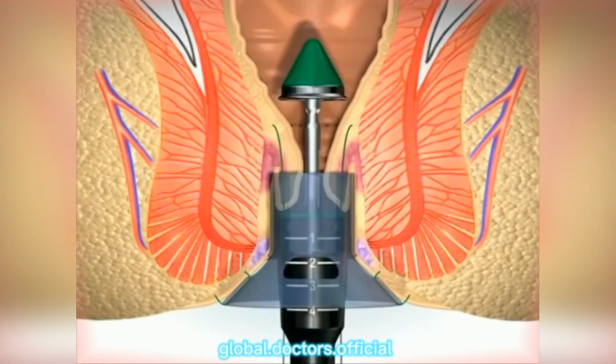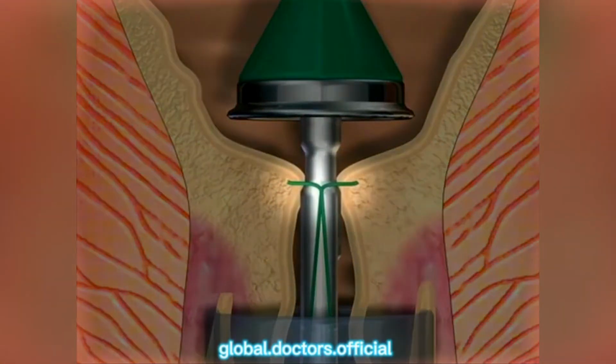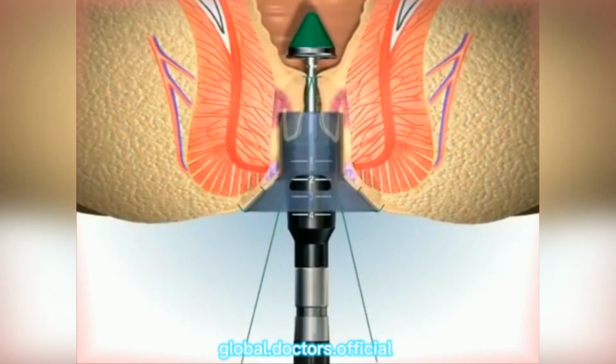inserted with the anvil placed beyond the purse string suture. It must be confirmed that the anvil crosses the purse string. A careful examination is conducted to confirm that the entire circumference of the mucosa is up against the center of the rod. A surgical knot is made to secure the tissue onto the anvil shaft, and with the help of the suture-threader, the ends of the threads are pulled through the lateral channels of the stapler.